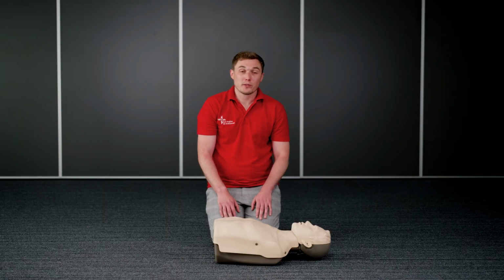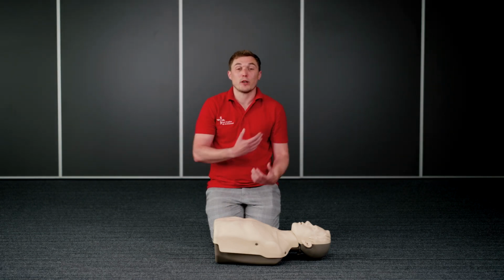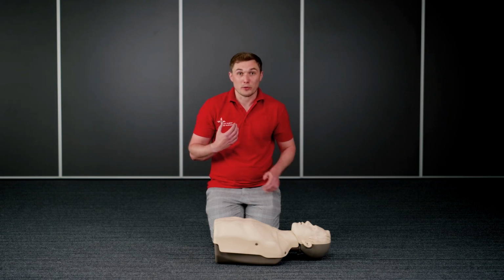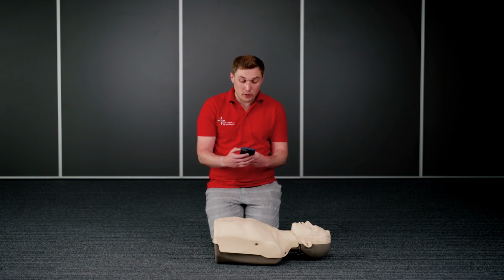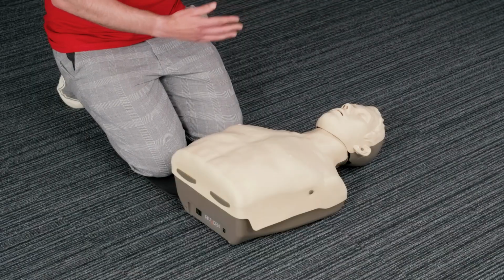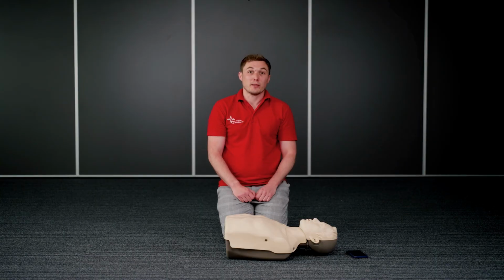After checking for a response, I then need to get some help here. I'm going to shout for help as loud as I can to try and garner some level of support from those around me. When someone comes over, I'm going to ask them to locate the nearest AED and bring it back as soon as possible. But I also need to call someone. I'm going to get my phone out and I'm going to call 999. I'm going to let them know that I found someone that's unresponsive and that I need an ambulance sent as soon as possible. And I'm going to place my phone on speakerphone, letting them know the location of where they need to send that ambulance.